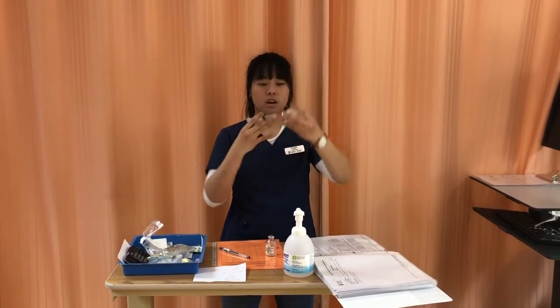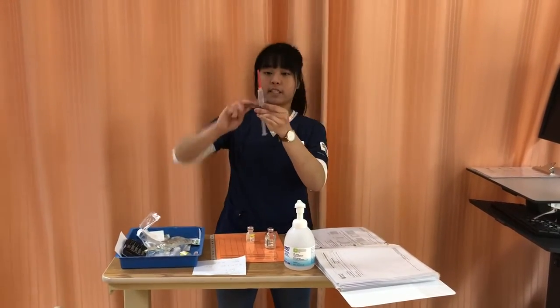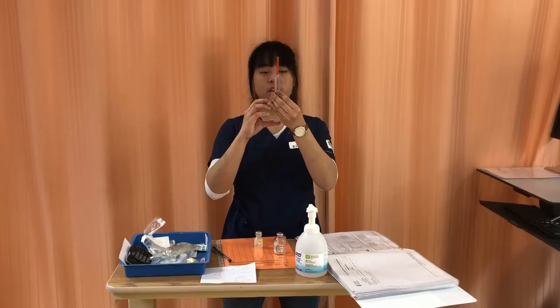Okay, and now that's about 8.2. And just recalibrate it, take out my excess air bubbles, at least 1/2 to 1/3. So I can do that. So I'm just gonna slap it. Okay.